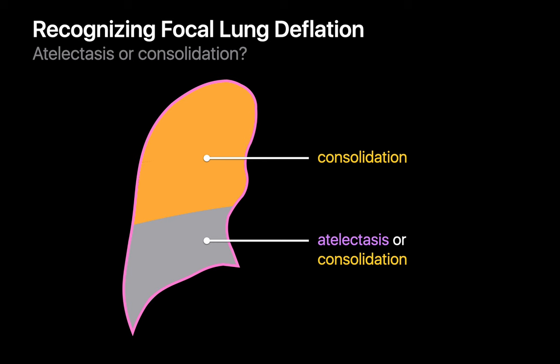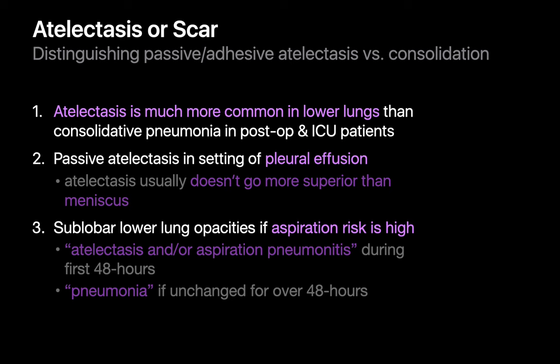There are three tips for lower lung opacities. One: statistically, in post-op and ICU patients, most lower lung opacities will be atelectasis, not consolidation. Two: in patients with a pleural effusion, passive atelectasis usually doesn't go higher than the pleural meniscus — if it does, seriously consider consolidation. Three: in patients with high aspiration risk, lower lung opacities under 48 hours old may be labeled 'atelectasis and/or aspiration pneumonitis,' while opacities unchanged for over 48 hours suggest consolidation or pneumonia.